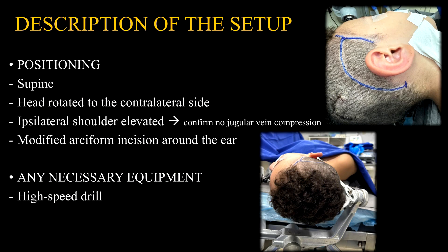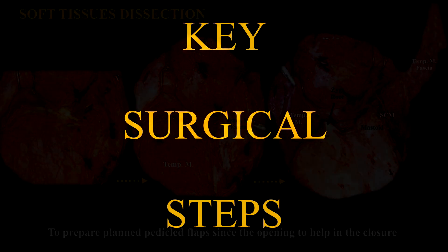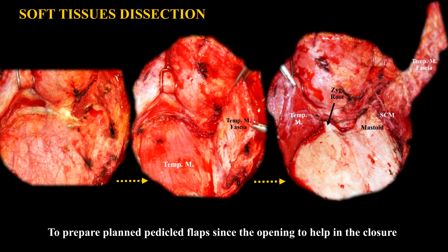The patient is positioned supine with the head rotated to the contralateral side and the ipsilateral shoulder elevated. It is important to confirm no jugular vein compression. A modified arciform incision around the ear is performed to allow exposure from the mastoid to the temporal region. Following skin incision, the fascia of the temporalis muscle is dissected while the scalp remains attached to the sternocleidomastoid muscle.